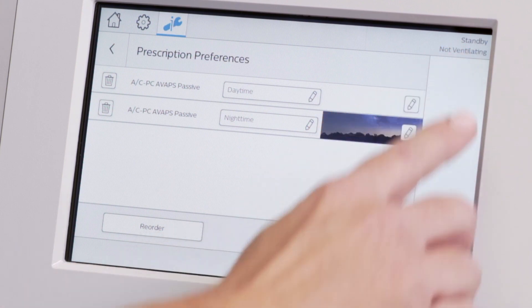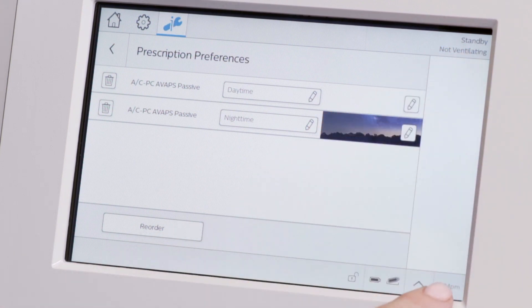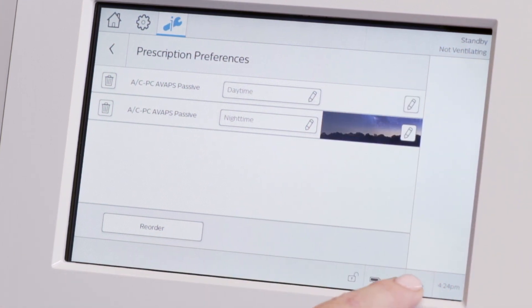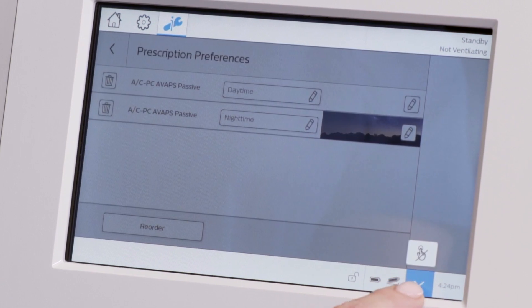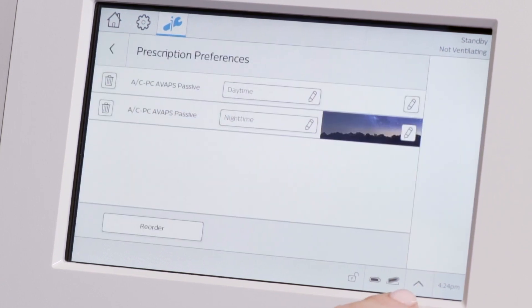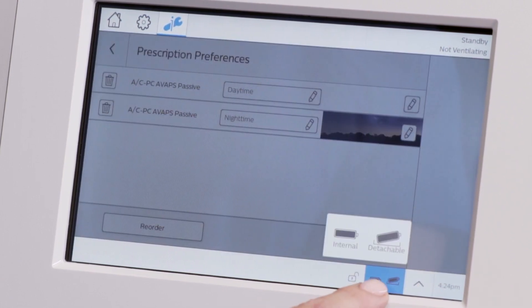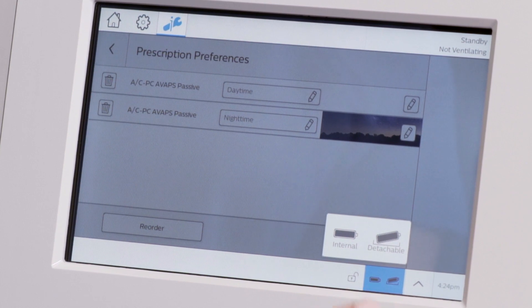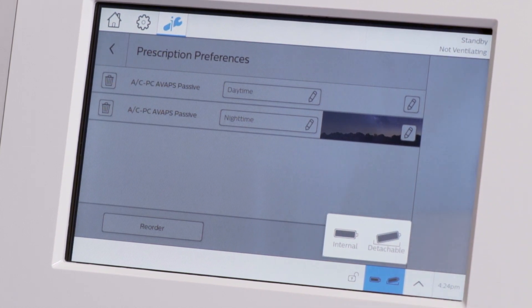At the bottom of the window, you will find the time and an arrow with the menu for touchscreen lock. You can check the status of the batteries by pressing the battery icon. Note that while ventilating, the device displays an estimate of the time remaining in each battery.